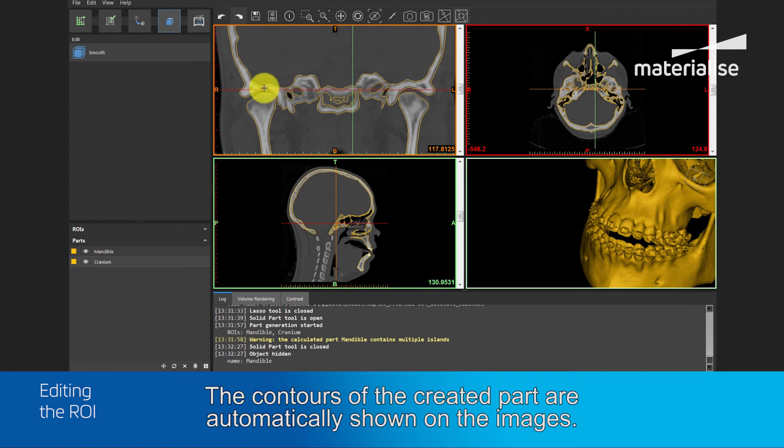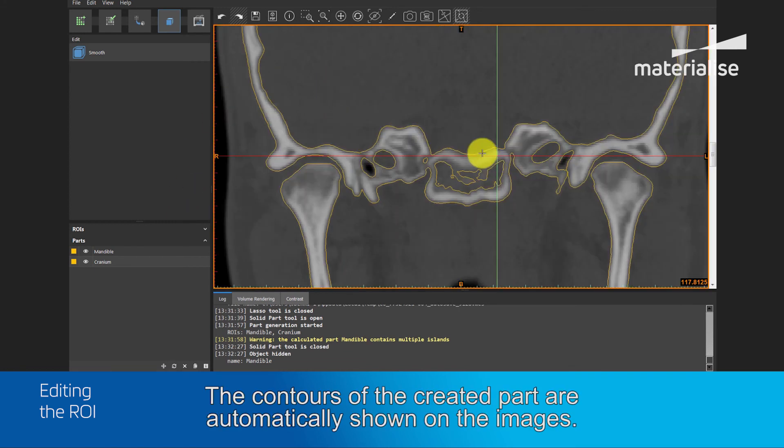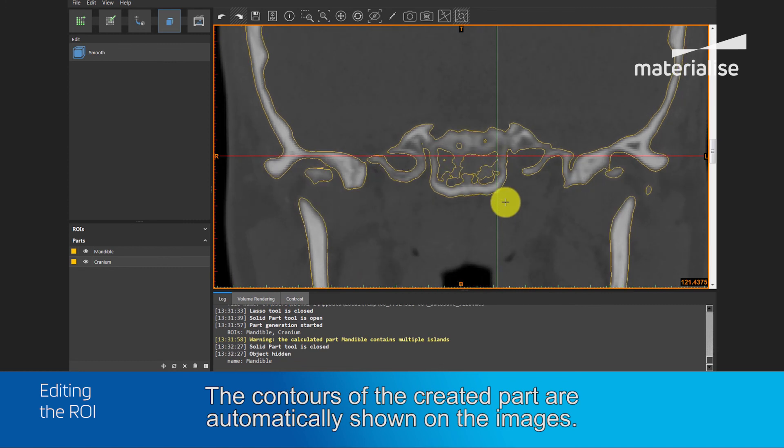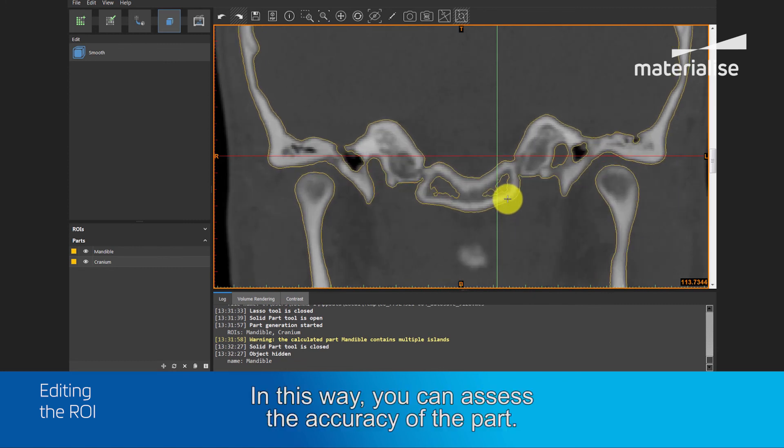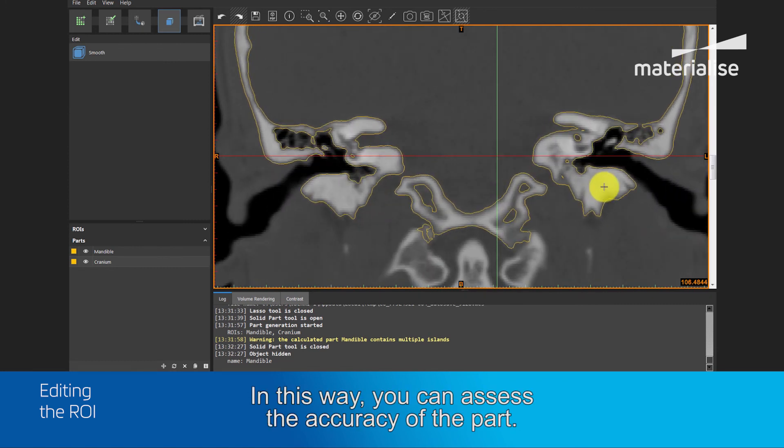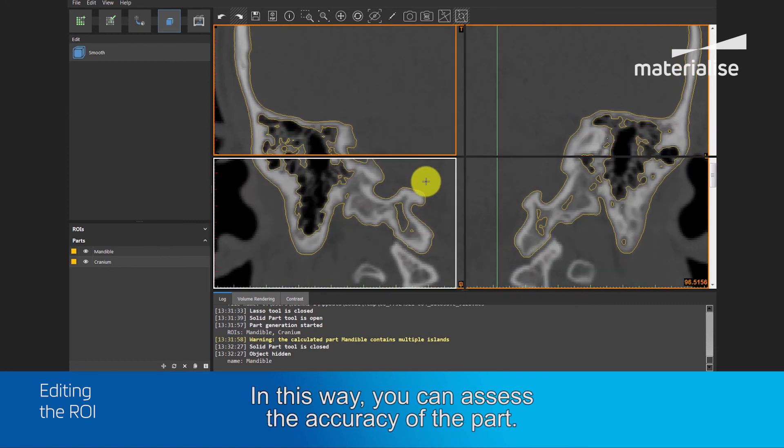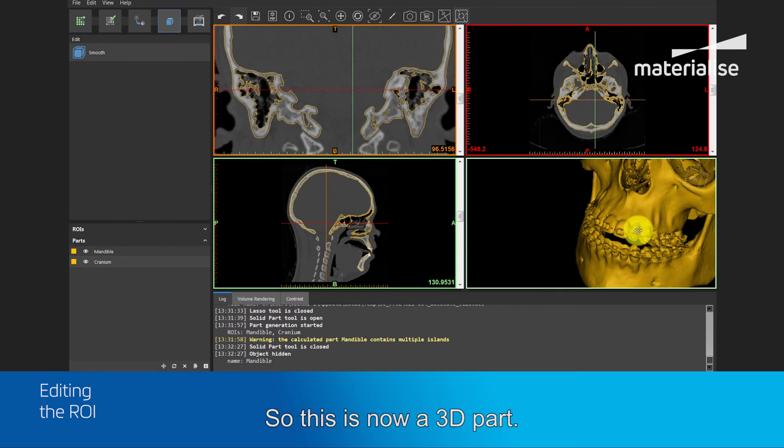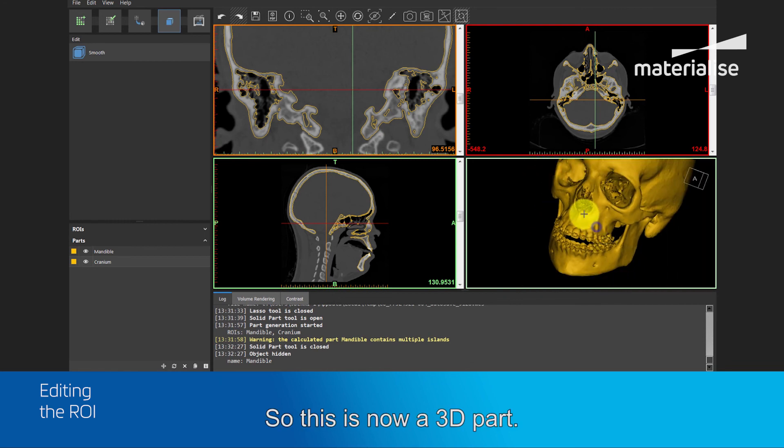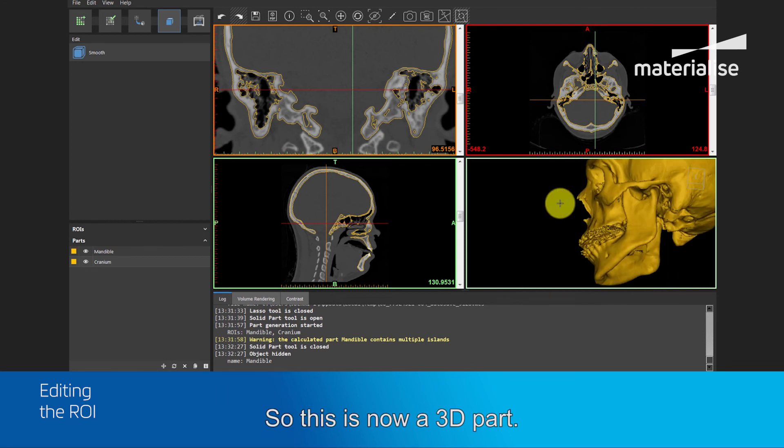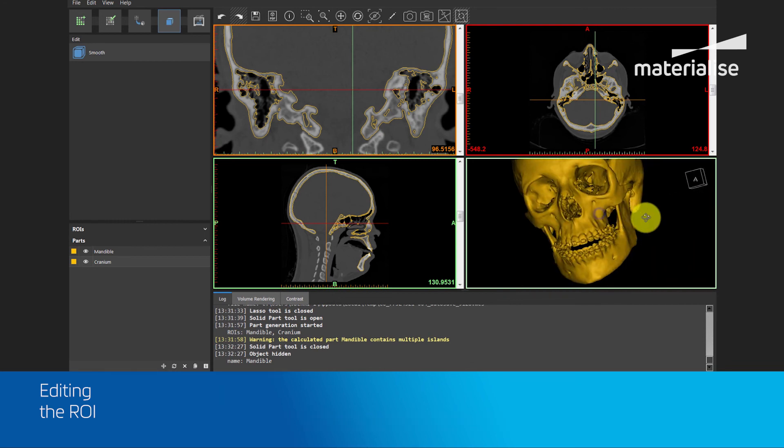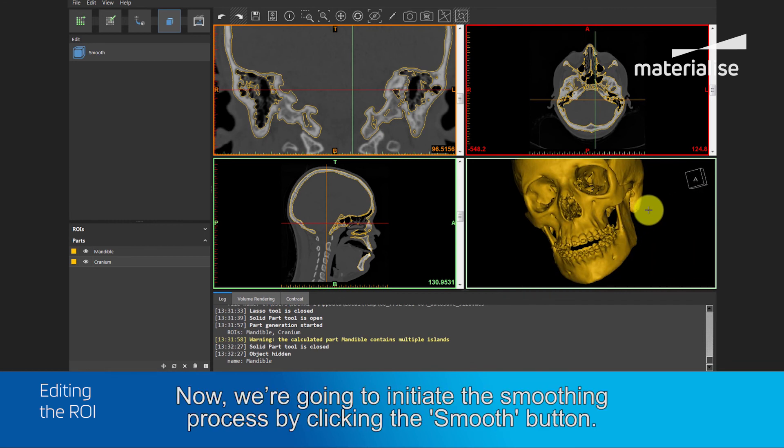The contours of the created parts are automatically shown on the image. In this way, you can assess the accuracy of the part. So, this is now a 3D part.